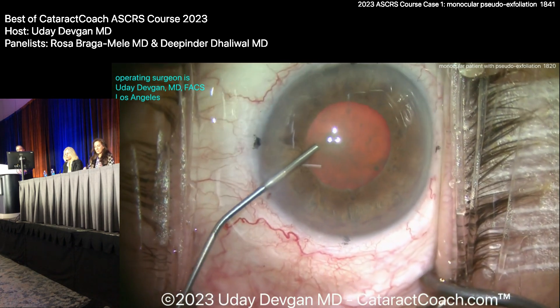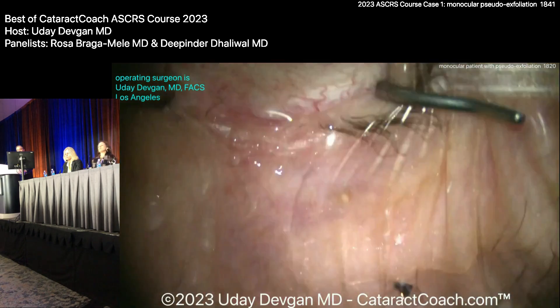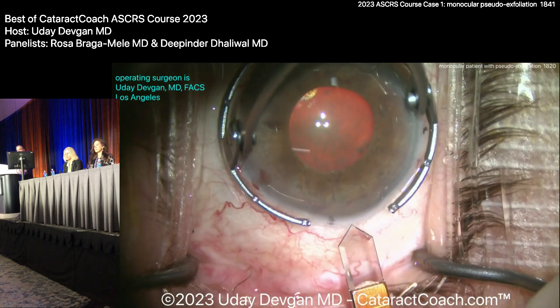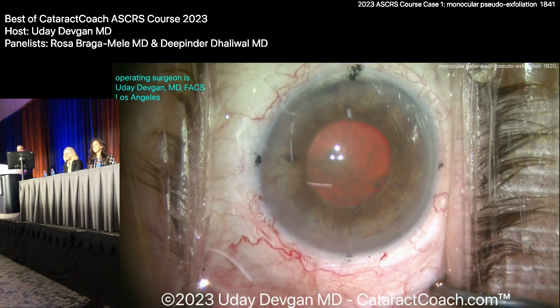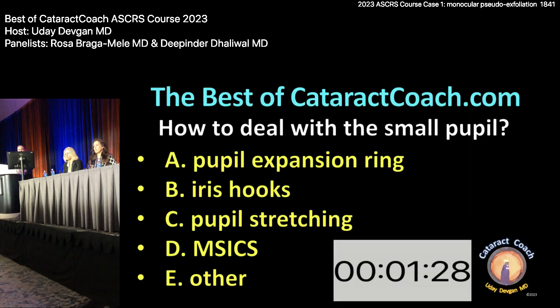I'll put some viscoelastic and some epi in the eye. I love patients for pre-op like this. Making the main incision. Now, what do I do here? Deepi, Rosa — pupil ring, iris hooks, pupil stretching, MSICS, or other? What are you going to do in a case like that? Monocular, 5mm pupil, 88-year-old lady.